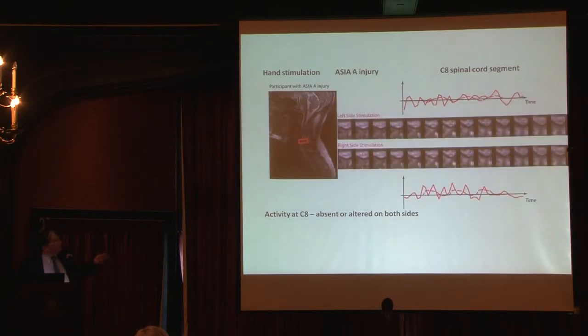Now, in comparison, here's a sensory complete injury, rated an ASIA A injury. In this example, for these 3, we've actually stimulated the same location of the body, looking at the same region.